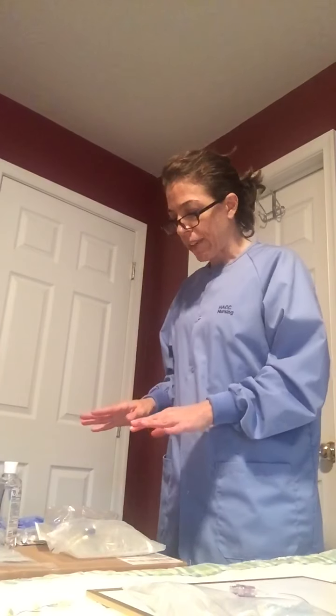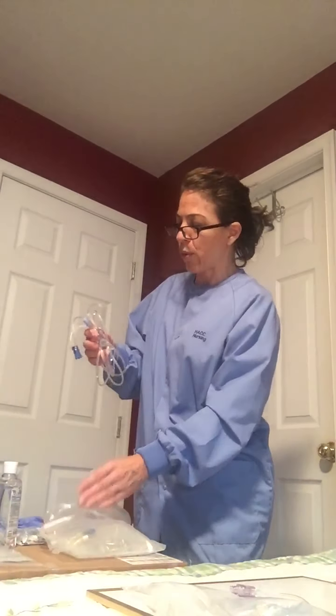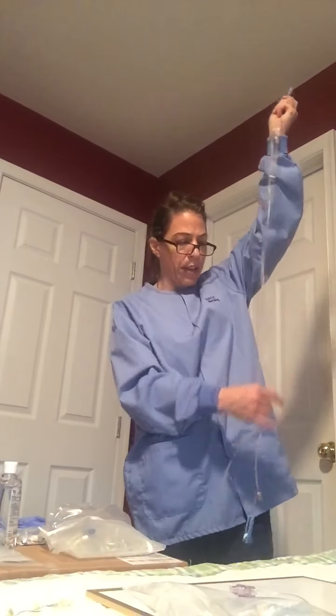So I'm going to go ahead and look at my supplies. I'm making sure everything's intact. Of course, I've been practicing, so things have been opened, but I would look to make sure things are intact. I would make sure the IV solution is not expired. So I'm going to open my primary tubing. Primary tubing is good for 24 hours, so I would want to label this with the date and time so that other shifts coming on know when this primary tubing needs to be changed.